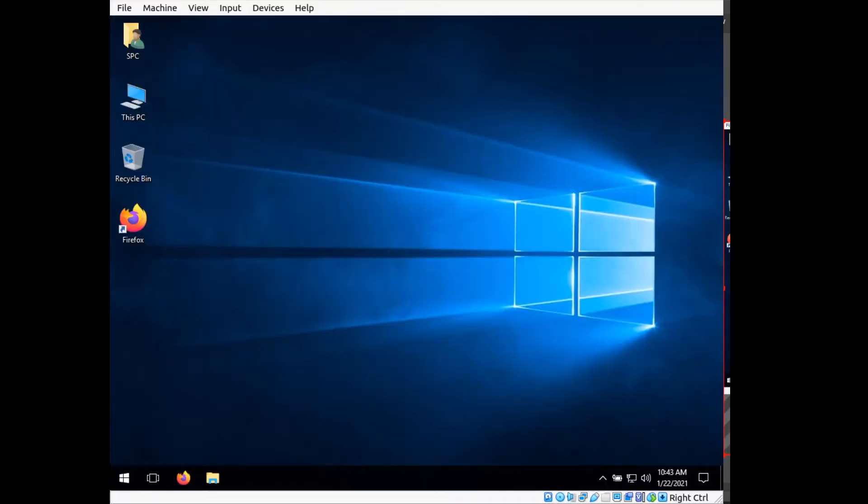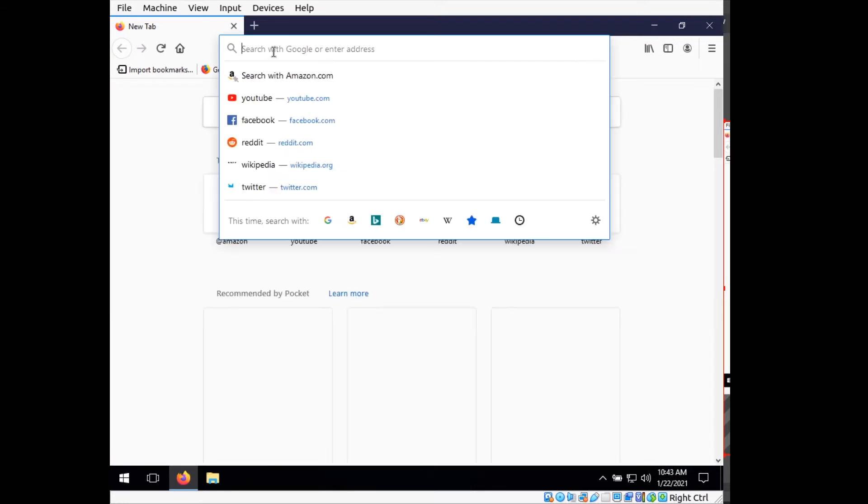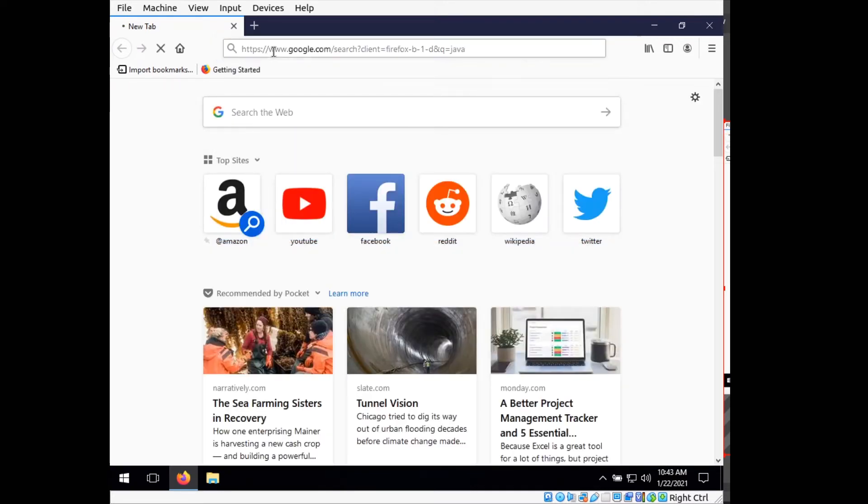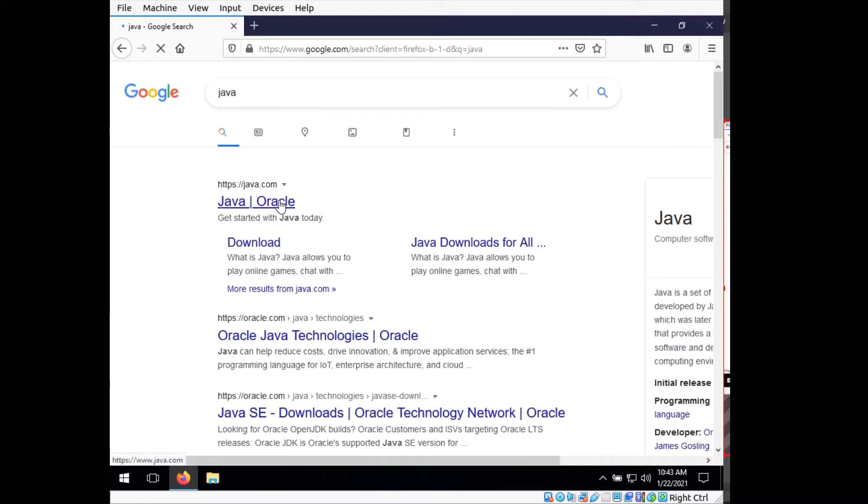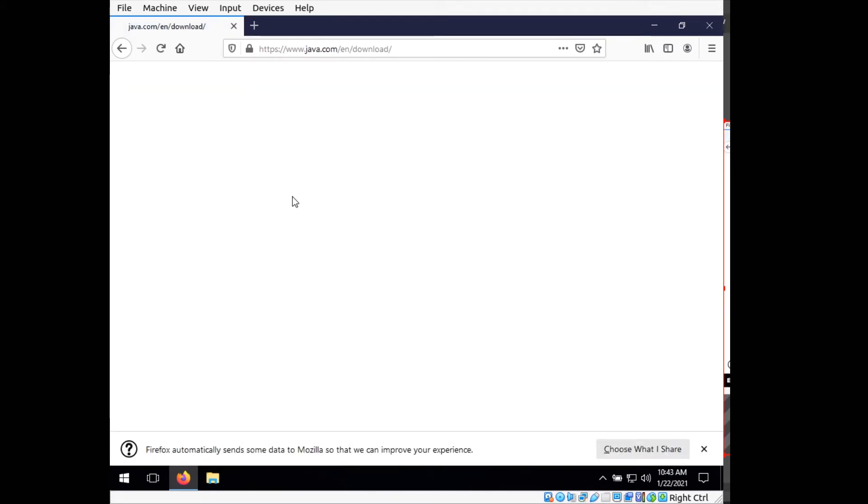Alright, so what I have here is my Windows computer, and I'm going to go ahead and go to my web browser, and what you need to do first is download Java. Your computer may or may not already have Java installed, but I'm going to assume that it doesn't.